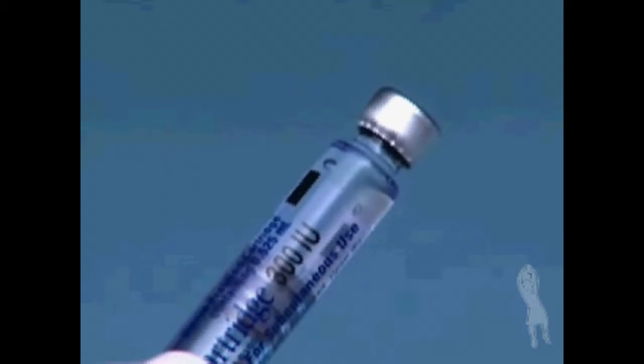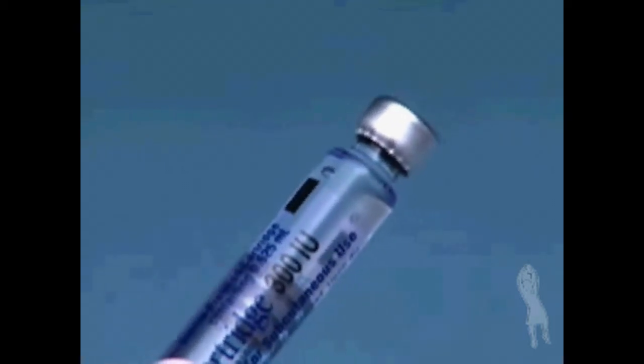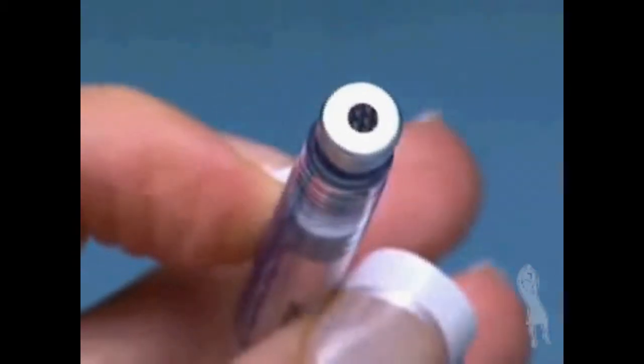Take a Follistim AQ cartridge out of its package. Do not use if it contains particles or is not clear. Clean the rubber stopper on the cartridge with an alcohol wipe.